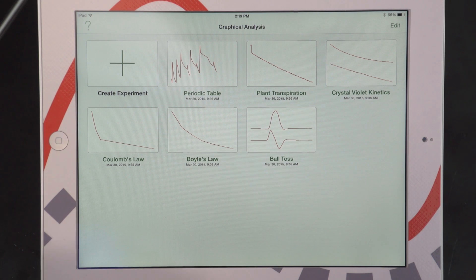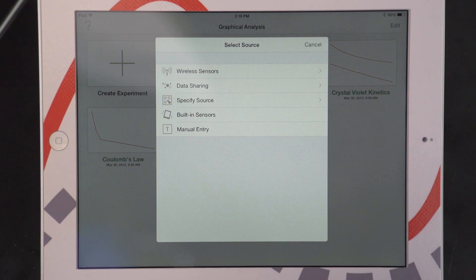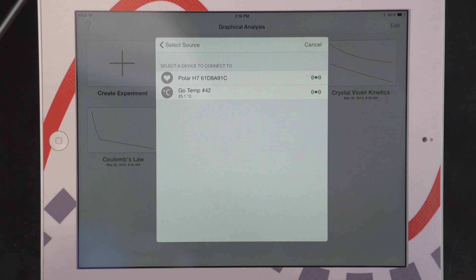Now that I am holding on to the sensor, I am going to connect it to Graphical Analysis. First, I select Create an Experiment. Then I'm going to select my source, which is going to be my wireless sensors. And I am going to connect to the module number that is connected to my hand grips.